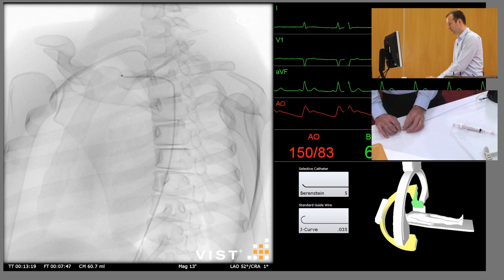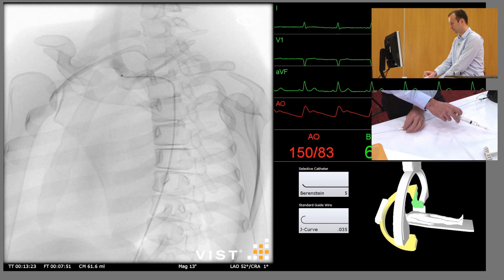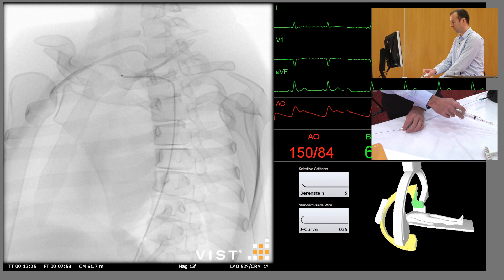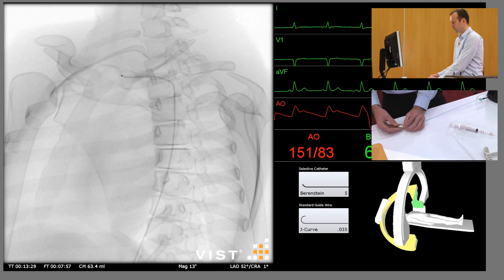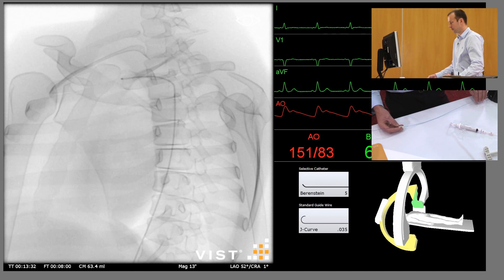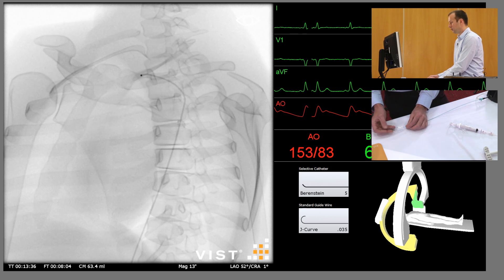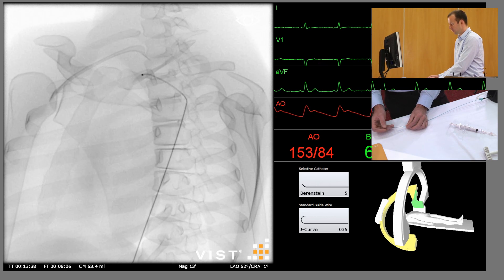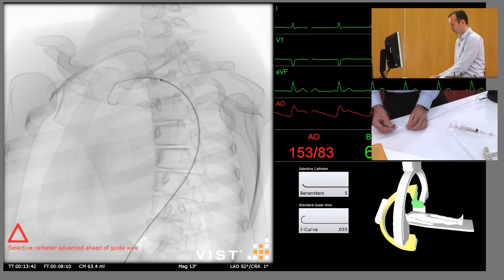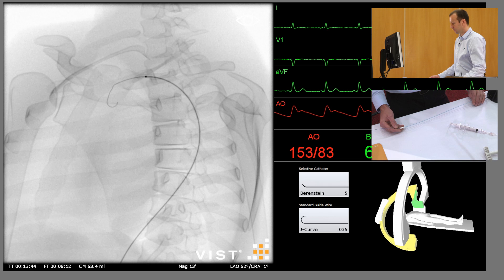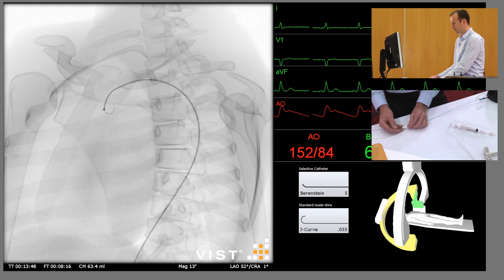We can check whether it's engaged the origin by injecting a little bit of contrast. And there we can see contrast going up the innominate artery, bifurcating into the right common carotid and the right subclavian. If we fail to engage and come past, what we need to do is reinsert the guide wire back around the aortic arch, advance the catheter back into the ascending aorta, and repeat the process.